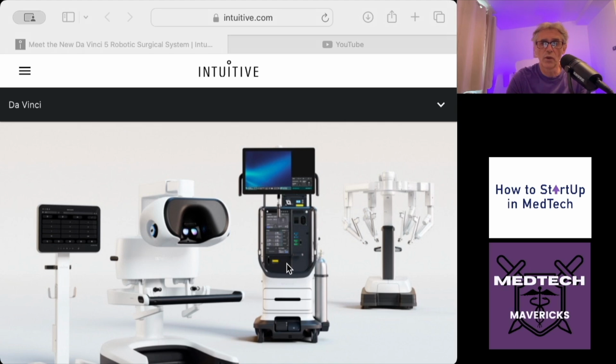And then what you've got under there as well is the vision system. So this piece down here, it controls the vision system. So all three are technically integrated. So the vision system talks to the electrosurgery talks to the high flow insufflation. They all talk to each other, throw off lots of data, by the way, which is important. But it means that you're always optimizing for the best image. Just an example, you fire up the electrosurgery, you burn some tissue and you throw off a load of smoke. Well, the smoke clearing function of the insufflator kicks in, and maybe the vision system slightly alters as well. I'm not 100% sure on that, but potentially.